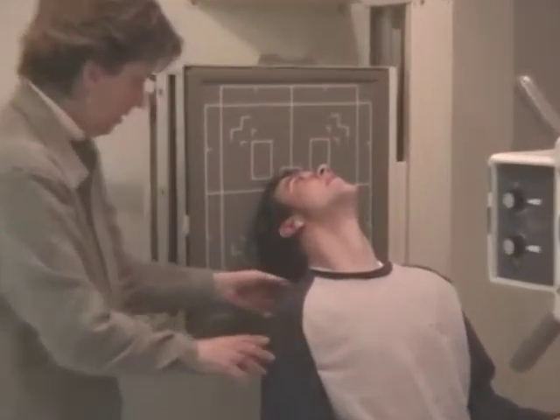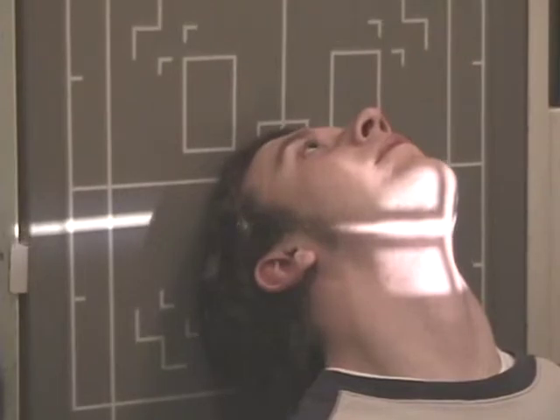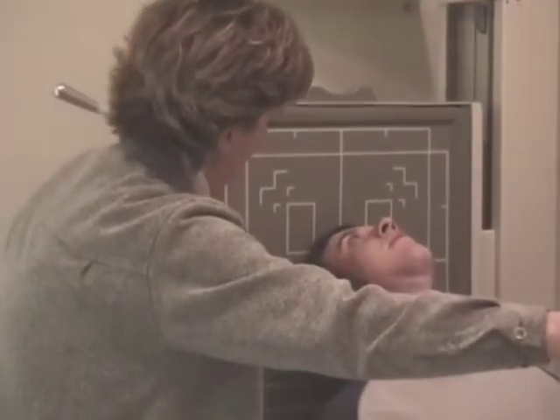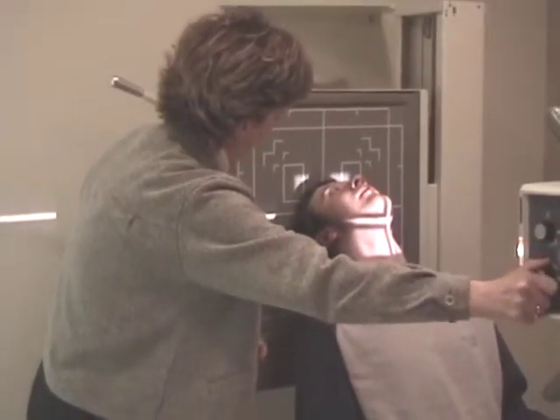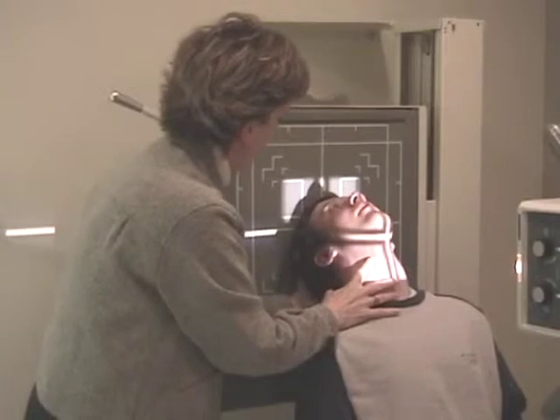Submental is a submental is a submental, and I'm going to position the infraorbital meatal line so it's parallel with the board. And I'm going to enter about 3/4 inch anterior to the EAM. And then I need to look at his, step in here and look to make sure he's centered and that the MSP is perpendicular. And I'm going to open the collimation a little wider than what you would normally have it, just to demonstrate a point here.